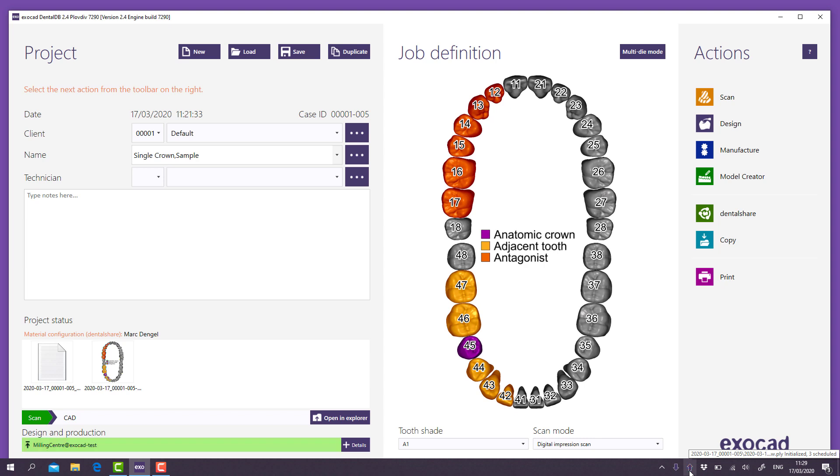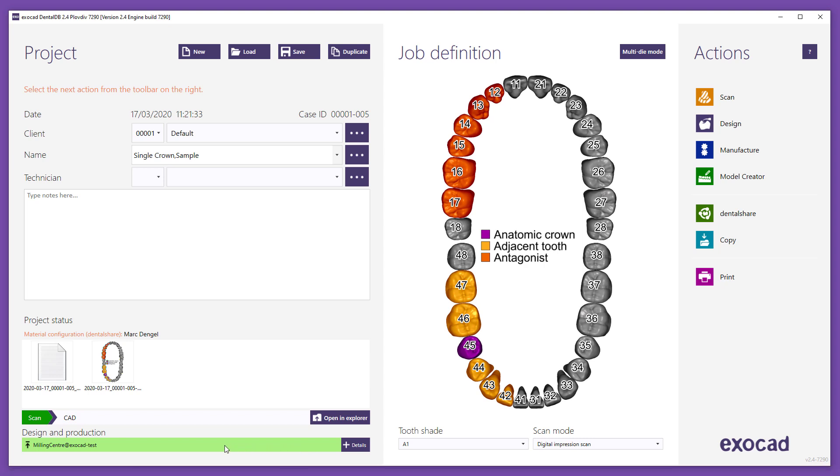A status bar appears in the bottom left corner of the window indicating the current state of the sent or received data via DentalShare and the current workflow state with symbols and colors.